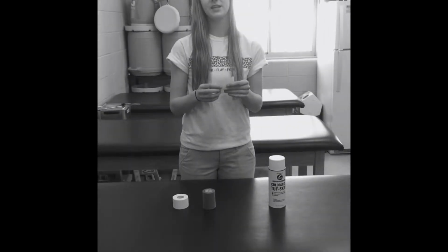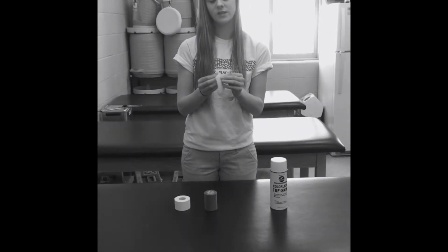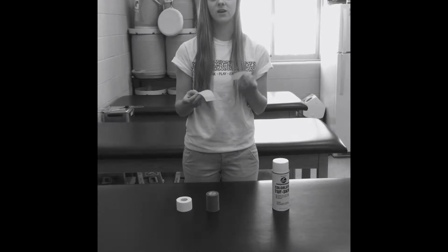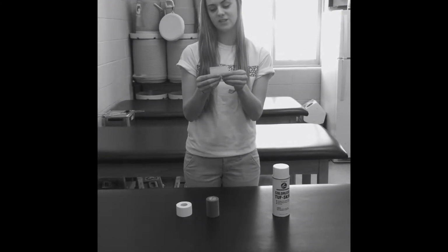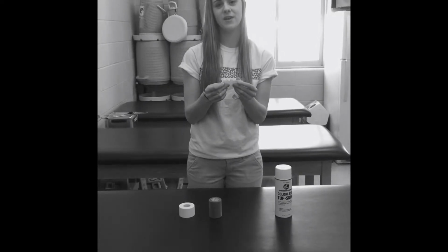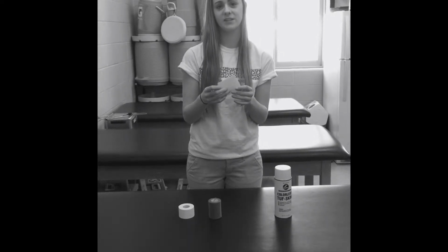The second material needed are heel and lace pads. One side of the pad is placed on the front of the ankle, one side of the pad is placed on the back of the ankle. The objective of these pads are to prevent blisters and tape from irritating the skin.